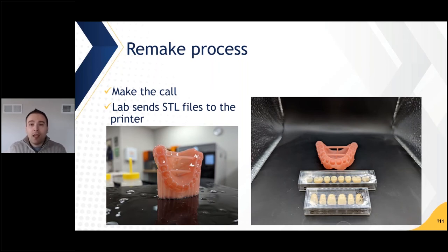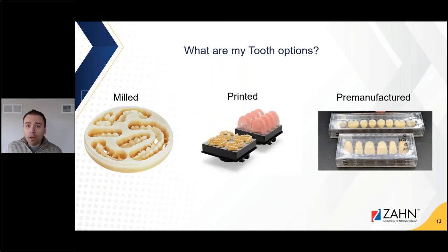So huge benefit. And if they have a break, we always suggest actually reprinting them. It's much more efficient to do it that way than to repair it. But if you ever do want to repair it or realign it, you can do that with the Lucitone 199.